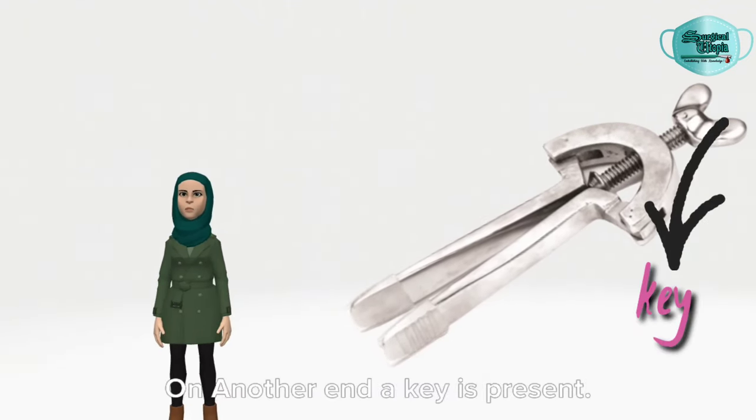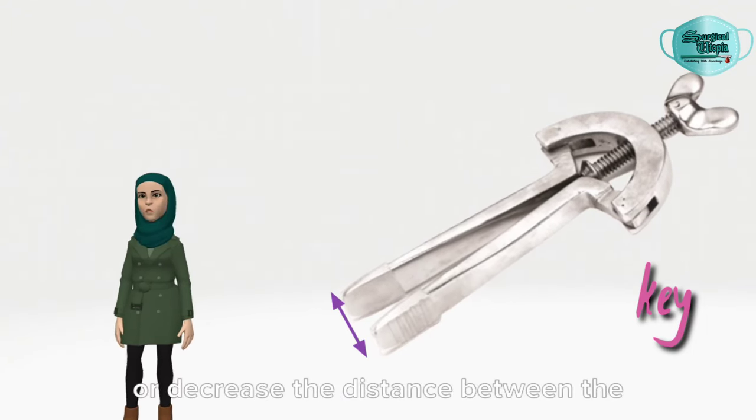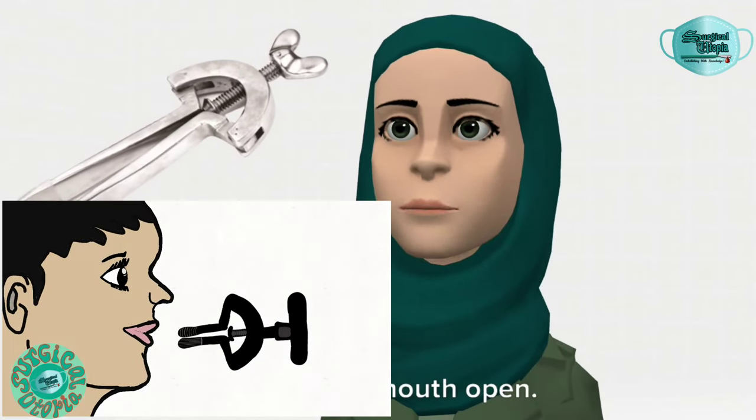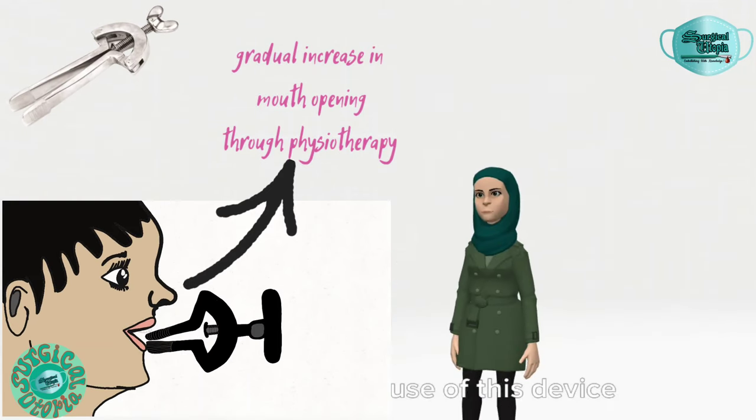On the other end, a key is present that is used to increase or decrease the distance between the two blades. The purpose of this instrument is to keep the mouth open during various minor and major surgical procedures.